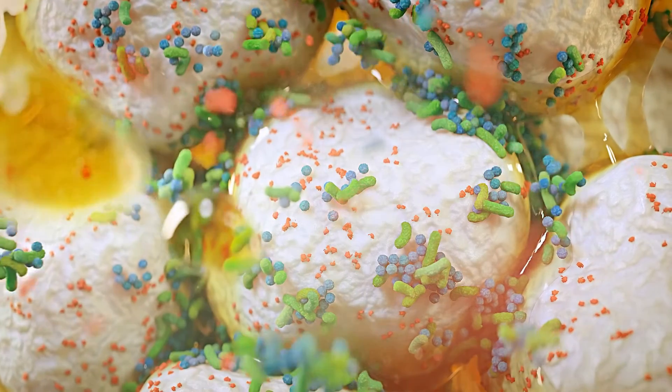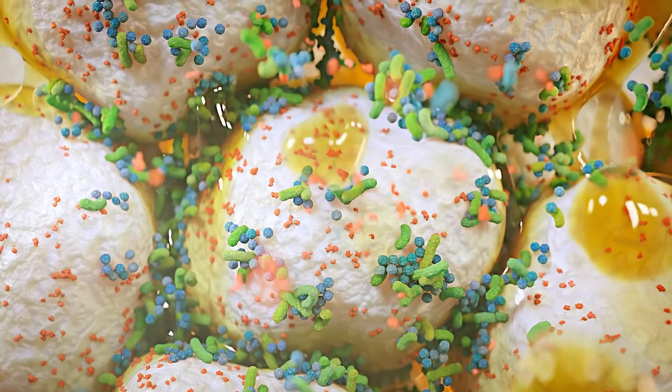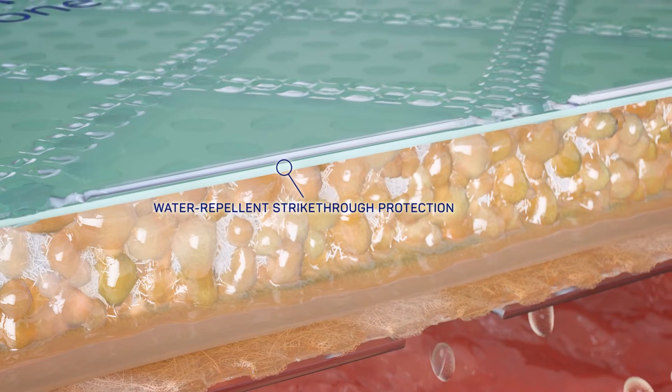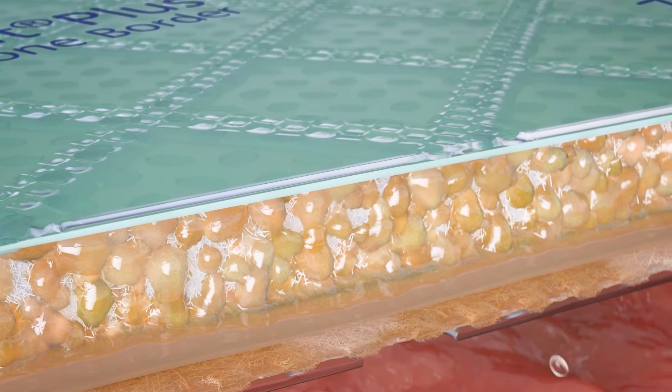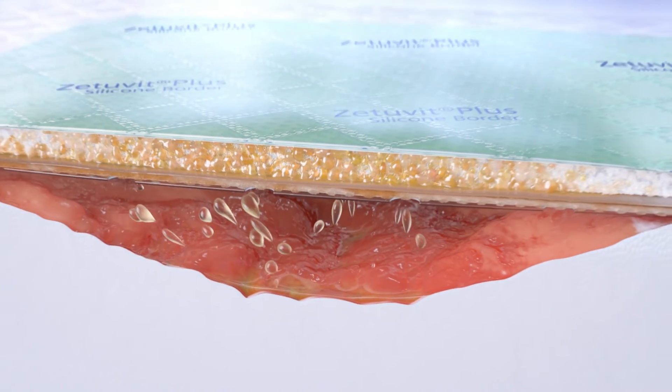Inhibitors of wound healing, like matrix metalloproteinases and bacteria, are bound inside the core. The green water-repellent strike-through protection is designed to mask absorbed fluid, and the transparent backing is waterproof and at the same time highly breathable.